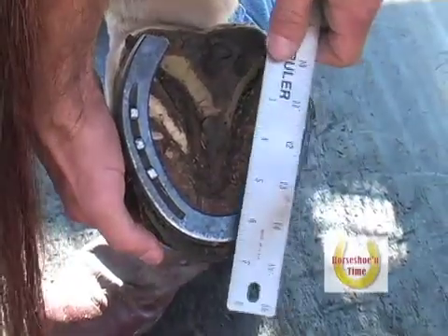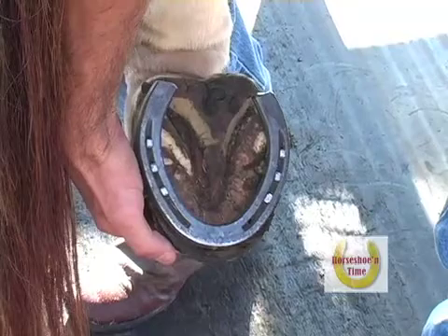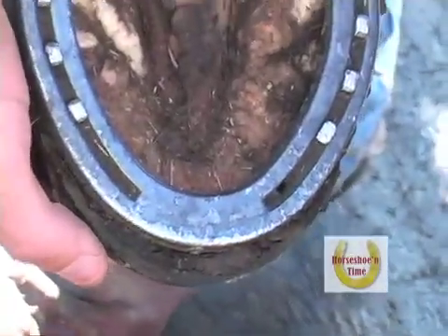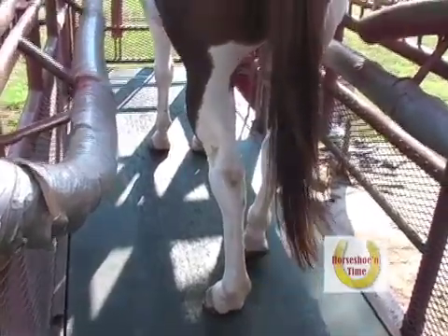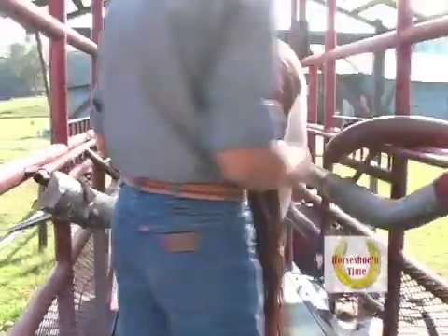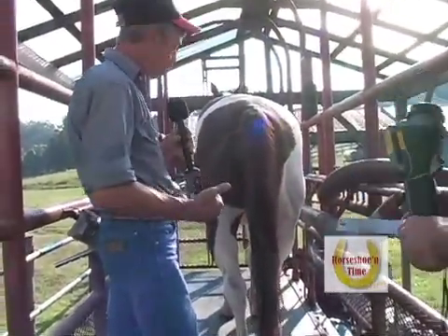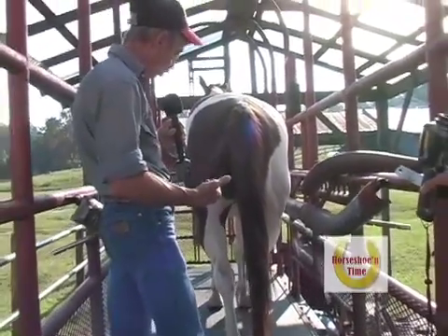We're a half inch when I set the shoe on, and we're a half inch now from behind the toe on the right hind. One of the things we just noticed is that the shoe has stayed in position — it's a half inch back where we had originally set it. By scanning the bottom of the feet, I'm seeing a lot more heat on that right hind at the toe where the horse is short-shod.